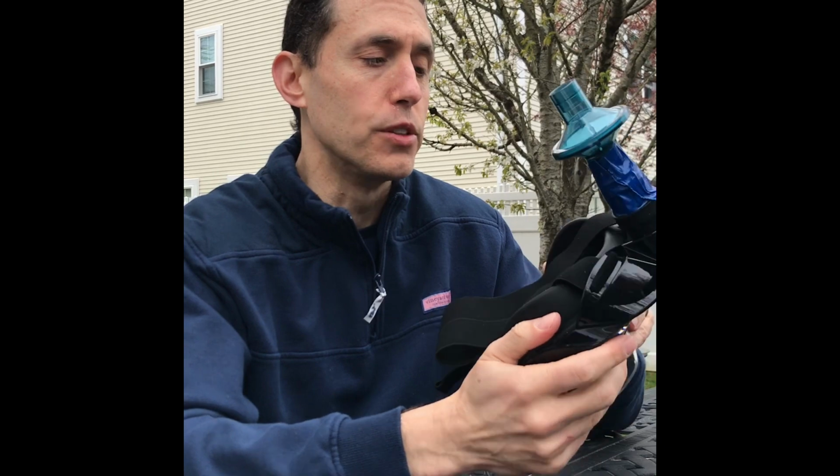A few issues will come up with these masks. First, how to best clean it. I don't know if there's a perfect way to clean it, but what I do is I wipe it down with a disinfectant wipe and then I rinse that off with water. Some people would dip it into a bleach solution, but I think any of those are probably going to be fine. The next question would be, which is the best filter to use?